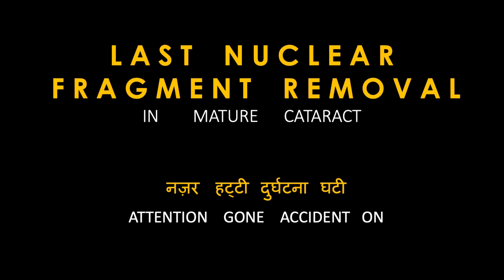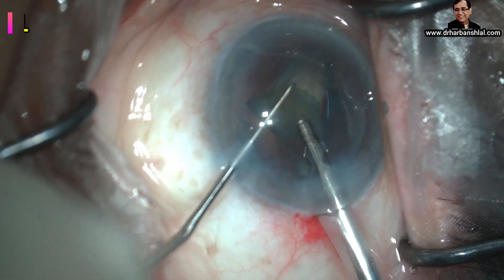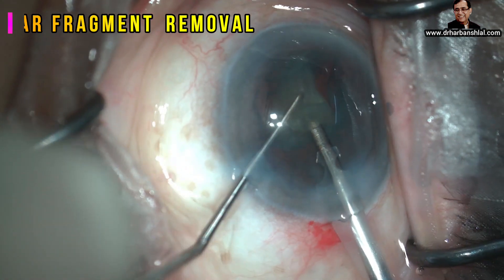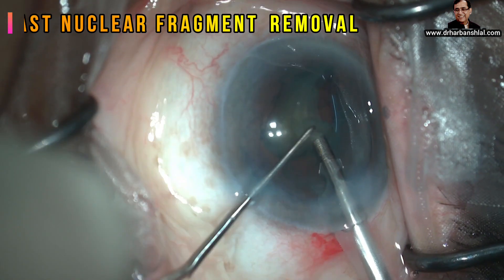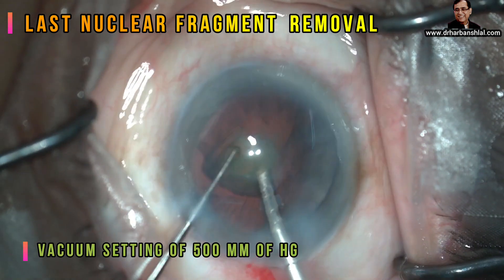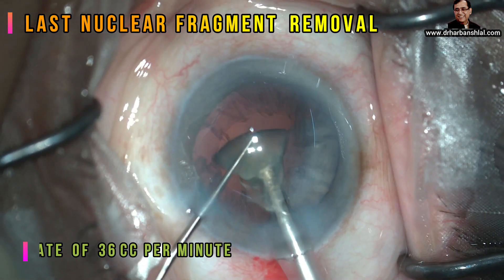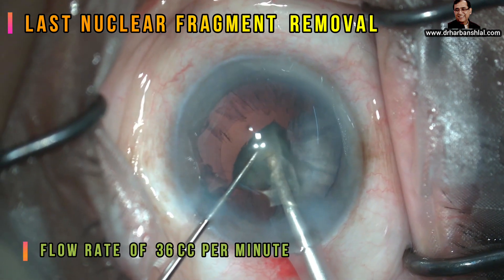Let us see how not taking the necessary precautions may result in posterior capsular tear. Here in this video, the last nuclear fragment of a white mature cataract is being emulsified using a Kelman tip at a vacuum setting of 500 mmHg and a flow rate of 36 cc per minute.